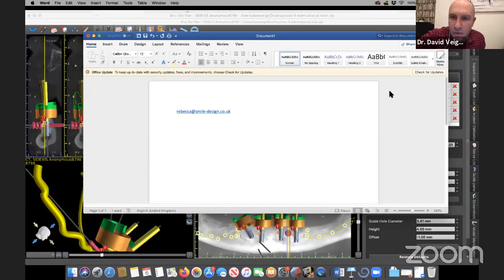Do you use any bite registration material between the upper and lower dentures during your cone beam CT scan? Yeah, good question. I would do that only if the patient doesn't have a very nice interdigitation. If they have a very flat occlusal plane posteriorly, then I would use a bite registration so that when my surgical guides are created, that same bite registration will allow me to position the two surgical guides in the right spot so that I can pin them into position.